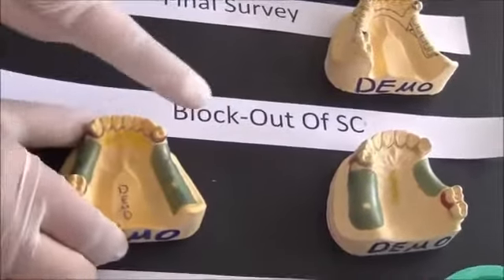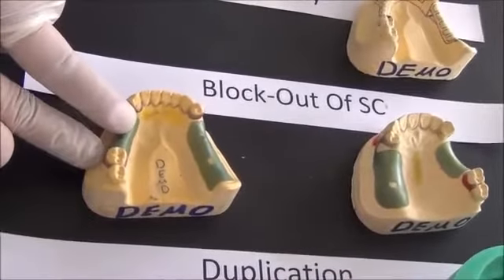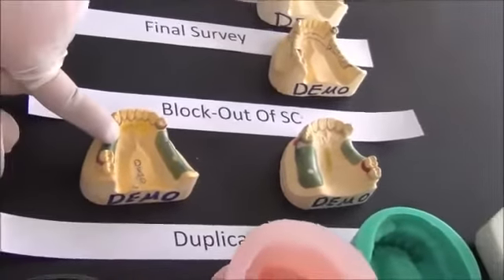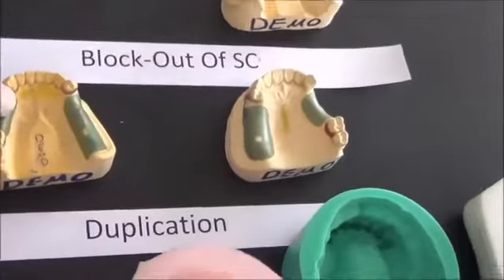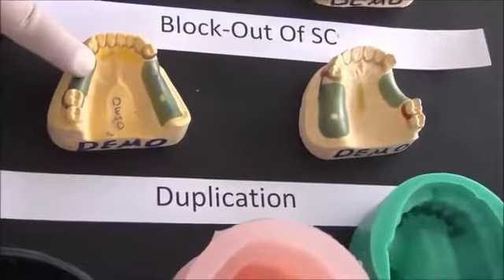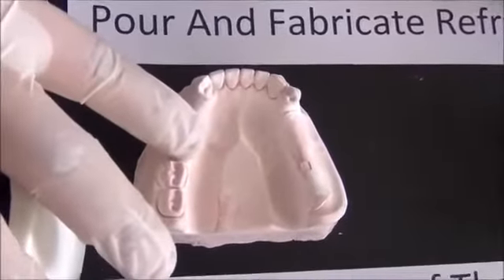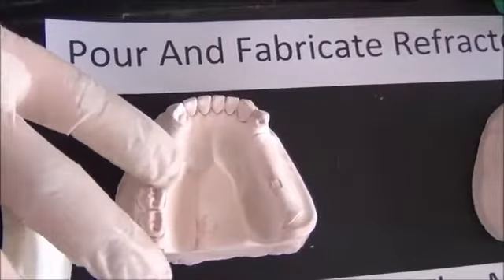This is the secondary cast with the blockout material on it, and we need to place metal over it. So this material does not stand metal. Stone does not stand the temperature of the casting machine. So we need to use another material that could stand the temperature of this process, and it's called refractory material.